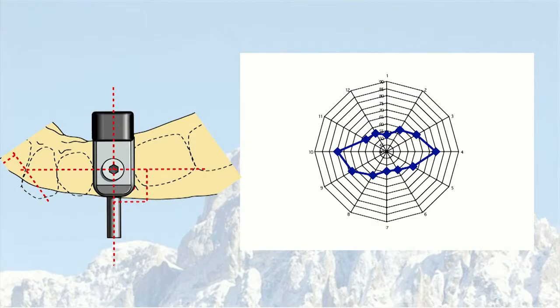With the wire technique, there were some drawbacks. For instance, we could, in a single-tooth situation, only place the transducer in buccolingual or buccopalatal direction. And we know from measurements we did in edentulous patients that if we rotate the transducer, we can measure different stabilities in different directions.